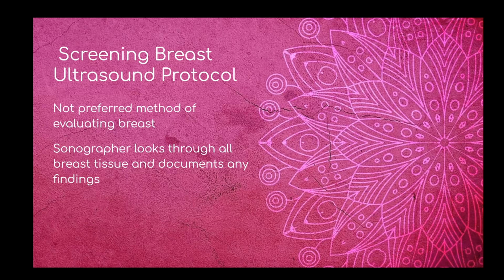What is preferred is to have a screening mammogram, and then followed by a diagnostic mammogram and ultrasound. Now, the only time that we might start with ultrasound is in younger patients who have palpable lumps that wouldn't quite be of age to start receiving mammograms. So I believe it's around 30 and over will usually get a mammogram if they have a palpable pathology.